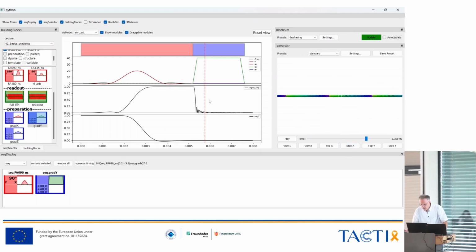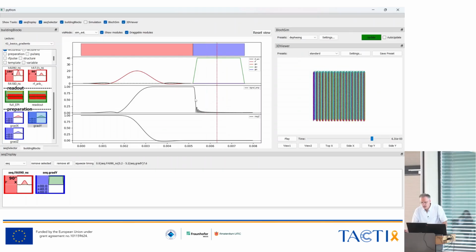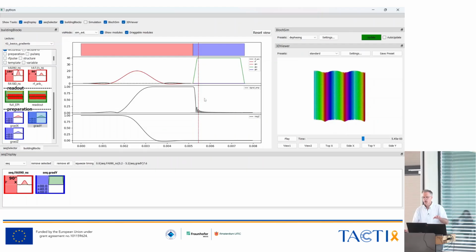No, it's not too nice. So we take this top view. There, the longer we leave the gradient on, we will get this stripe pattern. And this stripe pattern is associated to K-space. So switching a gradient and leaving it on means I'm moving in K-space to different positions.